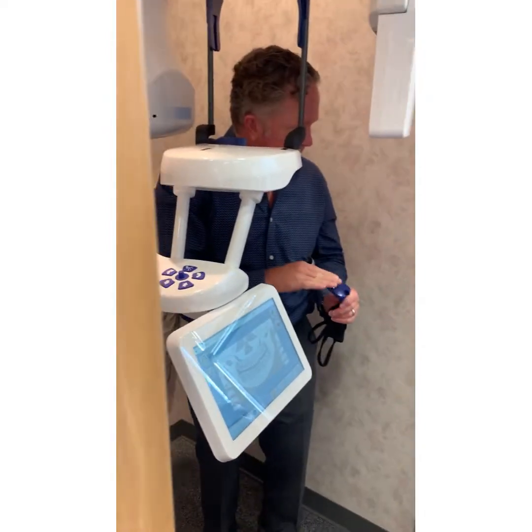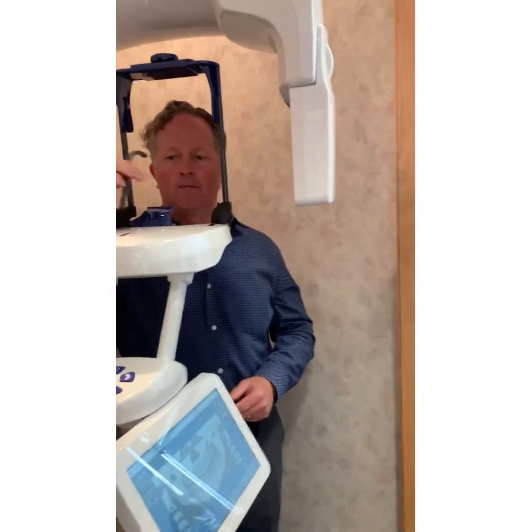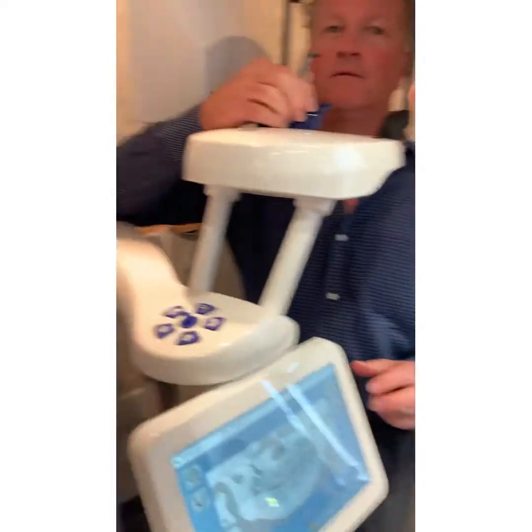Can we use this sleeve over the operation? No, just because in that case you have to touch it. Okay, so we'll just wipe it off of the bottom. Yeah. Do you have little plastic barriers to go over this, or does it matter?